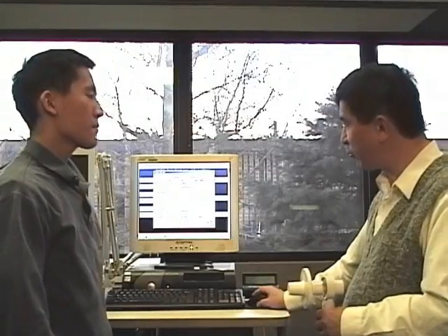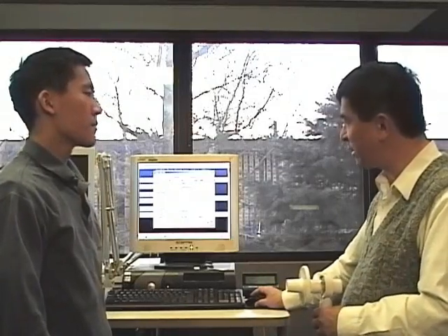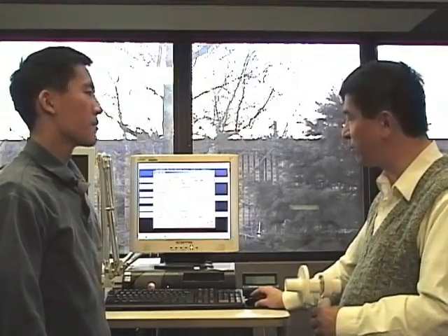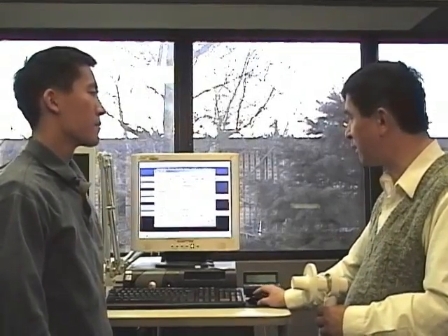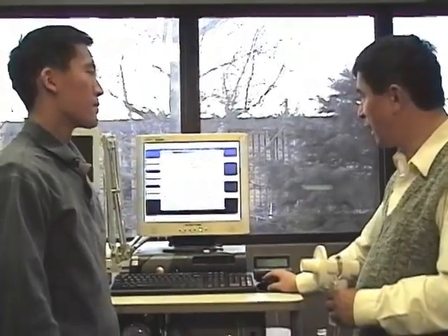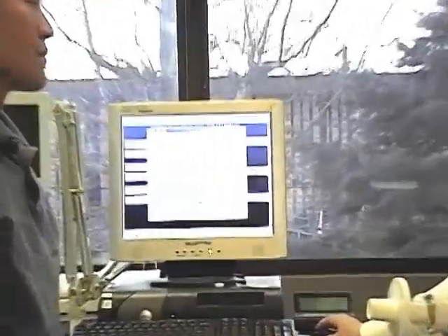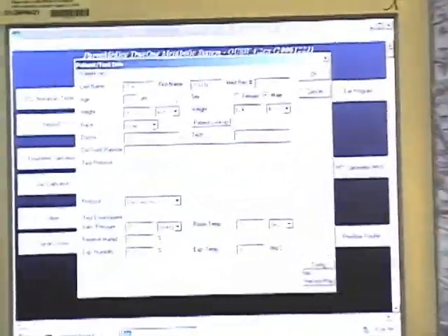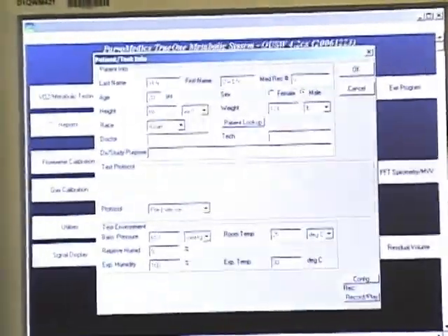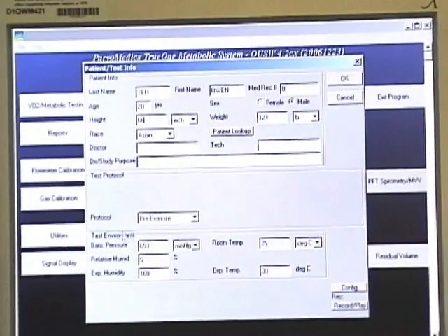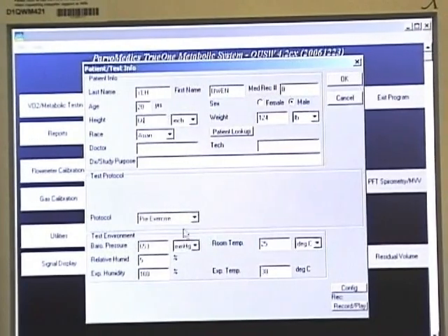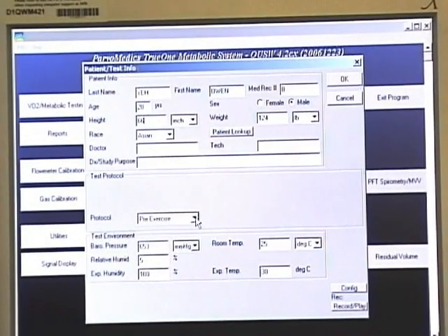For spirometry, first enter the patient information: last name, first name, age, gender, height, weight. And if that's a pre-exercise test, we enter pre-exercise.